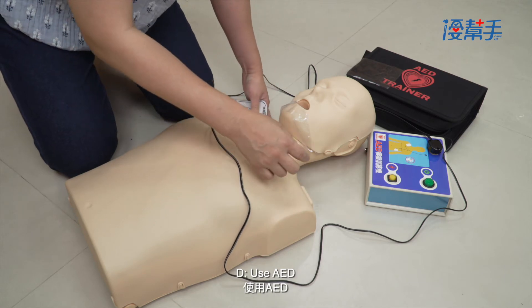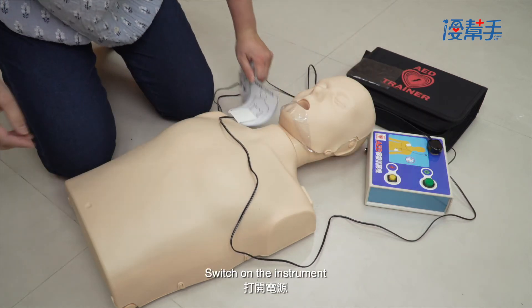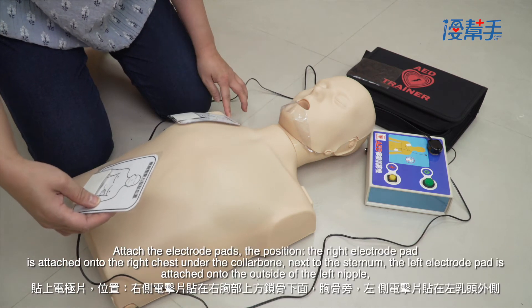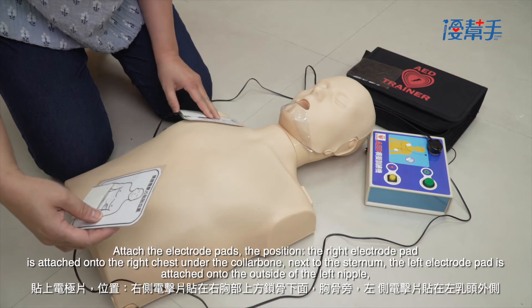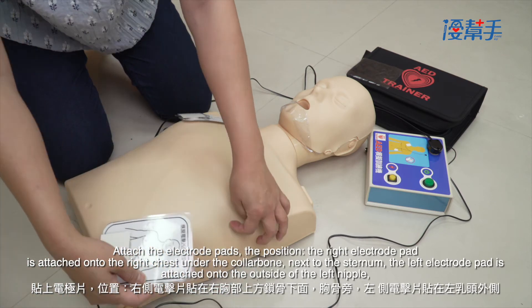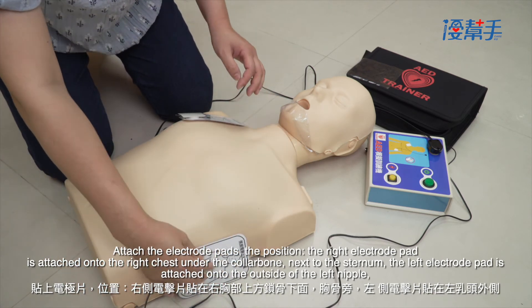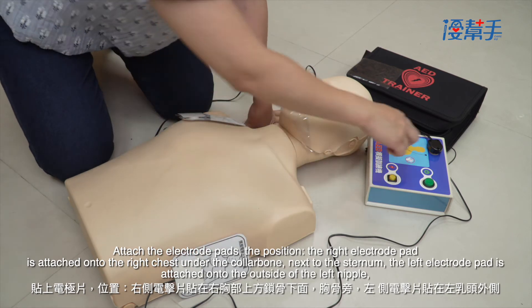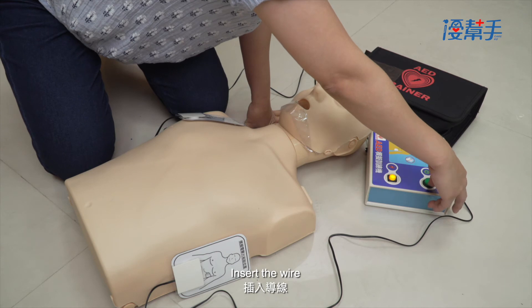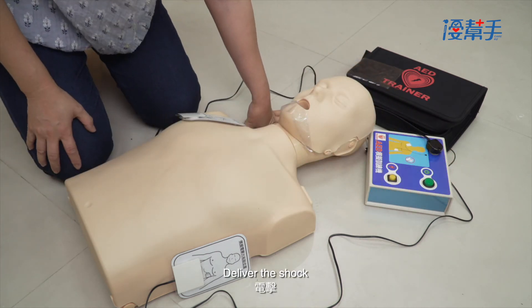Use AED. Switch on the instrument. Attach the electrode pads: the right electrode pad is attached onto the right chest under the collarbone, next to the sternum. The left electrode pad is attached onto the outside of the left nipple. Insert the wire, then deliver the shock.